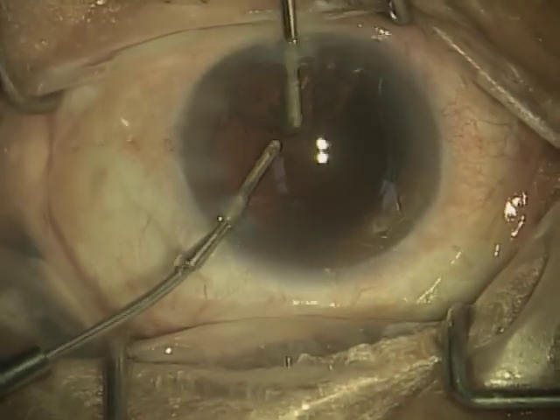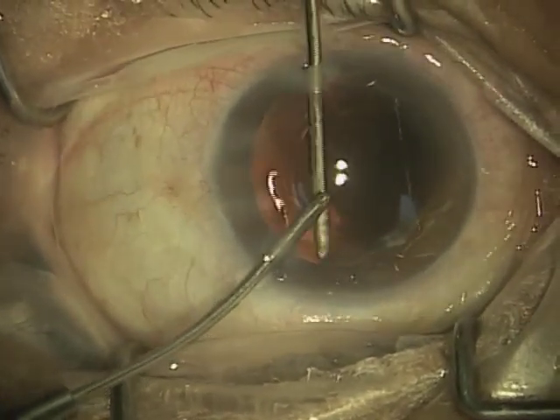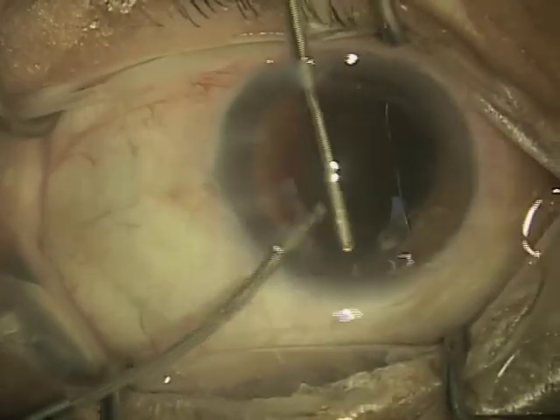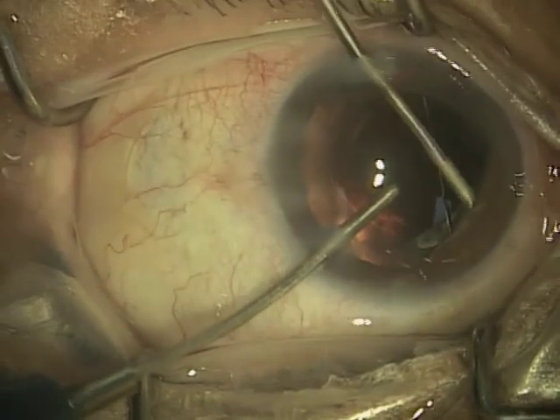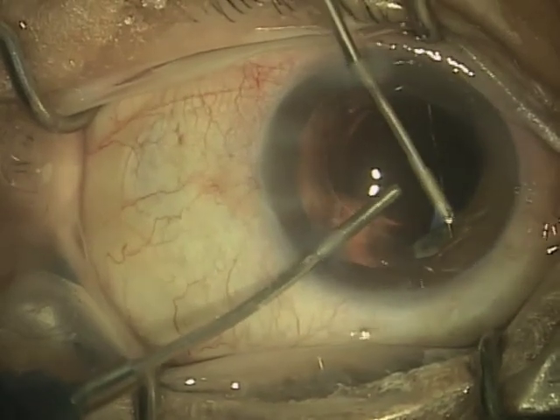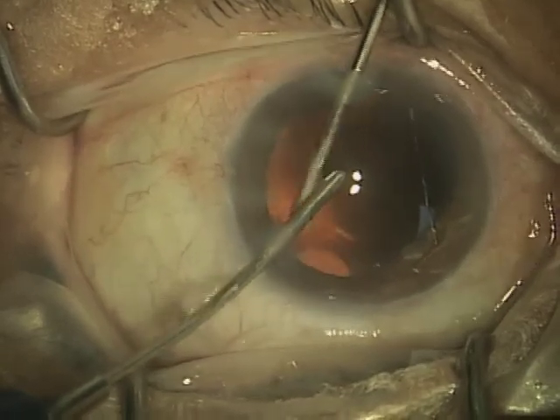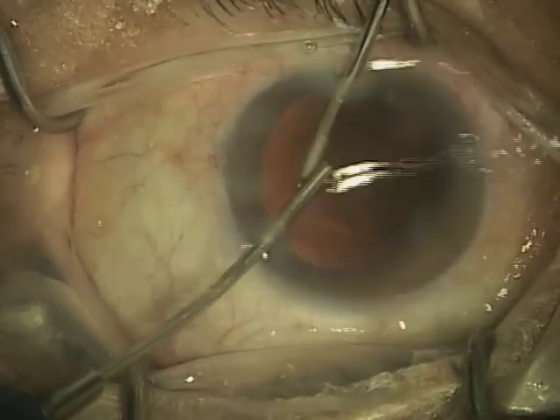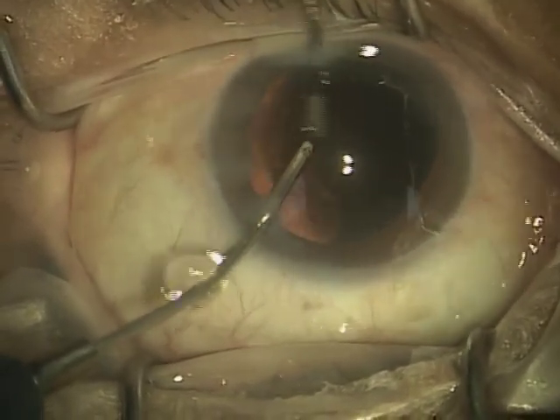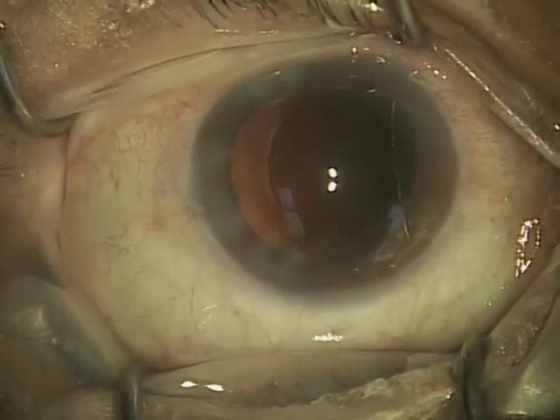Not everybody will polish the capsule, because again, it is very, very thin and delicate, so it's a little stressful on the surgeon's heart to polish it. But here you can see I'm polishing it, as I do believe that polishing the capsule results in a more controlled healing response, as that capsule shrink wraps around the lens and eventually holds the lens in position. So this is a relatively straightforward step, but because you're dealing with such a delicate membrane, it's not a step that everyone takes.